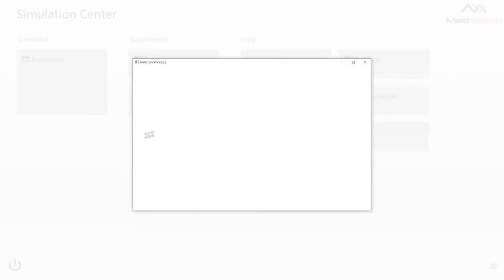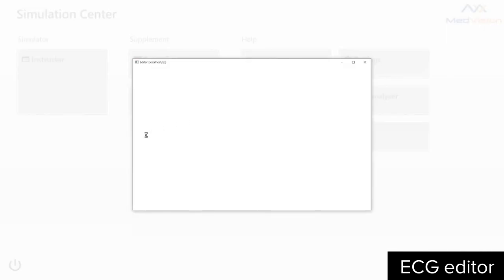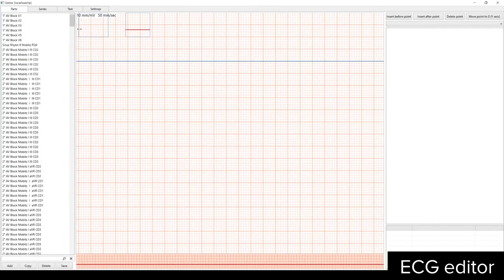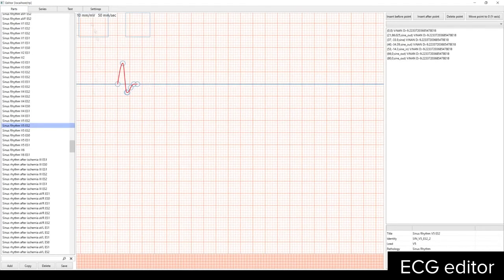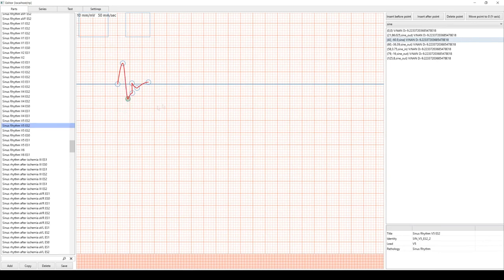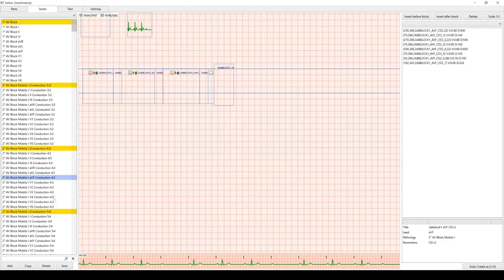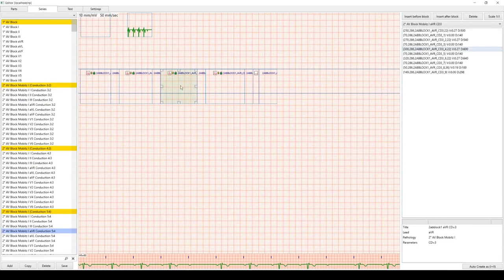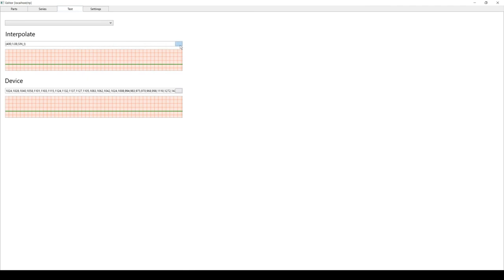In the ECG editor, users can change the ECG rhythm. After launching the ECG editor software, you can select a segment and configure it to what you want — even going to unrealistic parameters if needed. You can see your coordinates, preview how the waveform is going to look in a series, and test it before applying. Language settings are also available here.